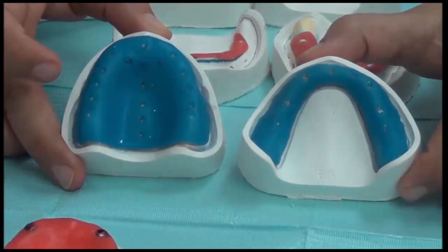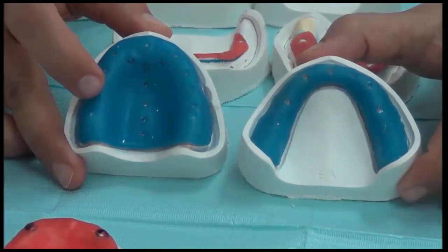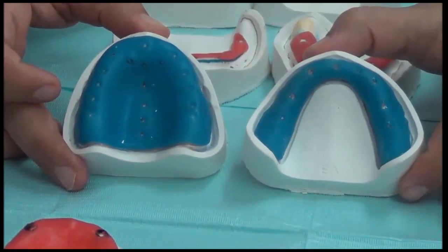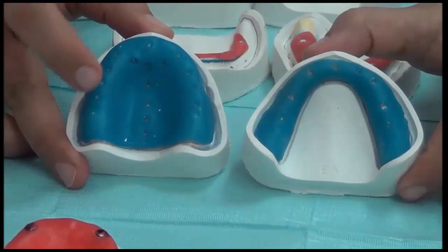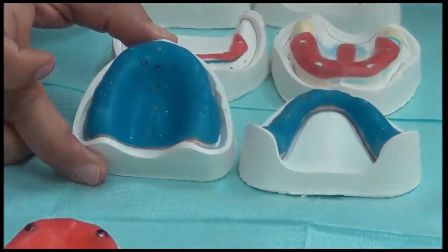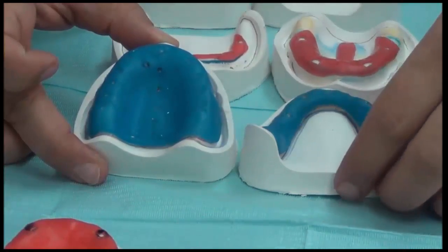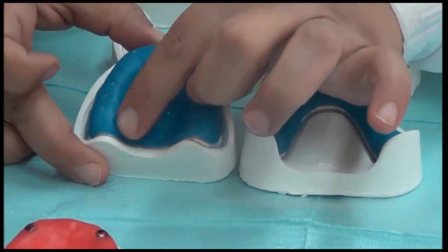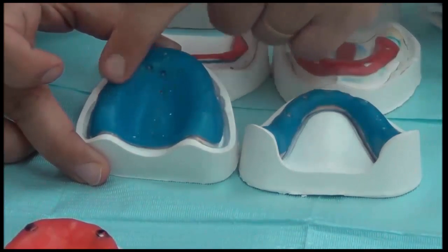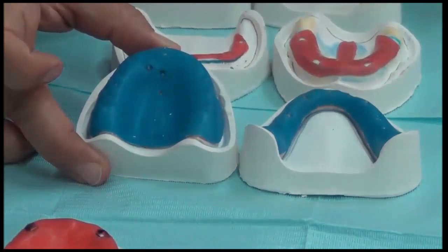And then, while we're taking the impression, the material will be squeezed out of these pores or holes, and this will reduce the pressure on these areas. While in the areas where no perforations are there, the impression material is squeezed between the hard tray material and the soft tissue. So this also provides tissue compressive properties in areas, while in the same impression we're doing some tissue static impression for the areas where we have holes.